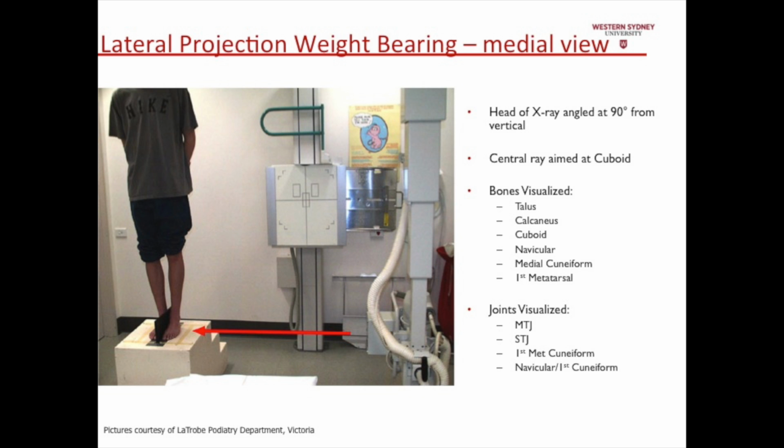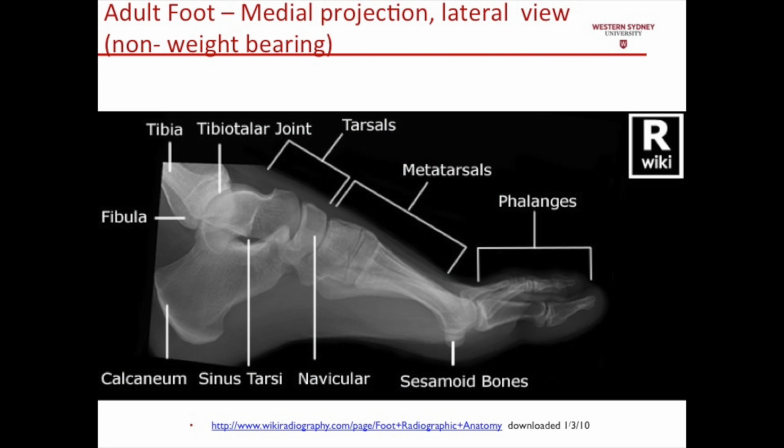What we can see in this instance is that we have the X-ray source directing the beam to hit the lateral side of the foot with the imaging receptor placed between both feet. In this slide you've seen this one before.